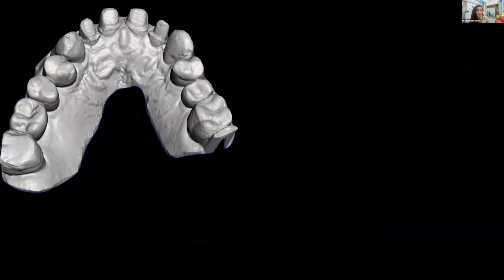With respect to setting patient expectations, when you open a bite with a material like that, what's your verbiage for a patient, or what are you telling them they can expect? Because I know certainly with a lot of the printed stuff, I like to err on the side of, hey, if you need crowns in like 6 months, don't be mad at me. And if it lasts you 6 years, cool. 100%. Curious with some of the milled hybrids, what your verbiage is for that.